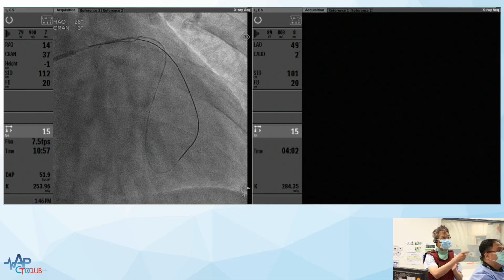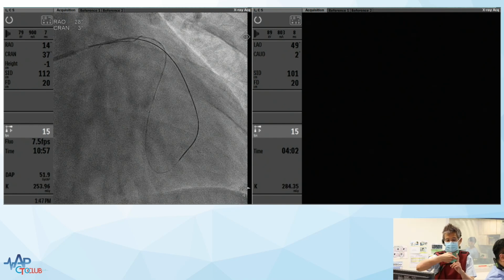Not necessary, because there are two things you can do. One is you can still get an IVUS in with this microcatheter because the retrograde wire is not inside the guiding. There's still enough space to check with IVUS if you wanted to, but it's going to be tight because you need a wire to track the IVUS. The other thing you can do is put a Conquest wire down the LAD, turn the wire and see if you can hit the retrograde wire. If you hit the retrograde wire and feel resistance with the Conquest, then you're in the same lumen. And as long as you're in the same lumen above the diagonal, you're okay. So I think those would be the two conditions that I would consider for tip in.